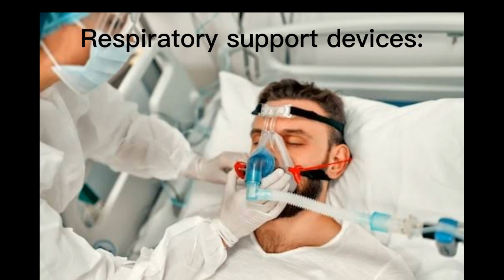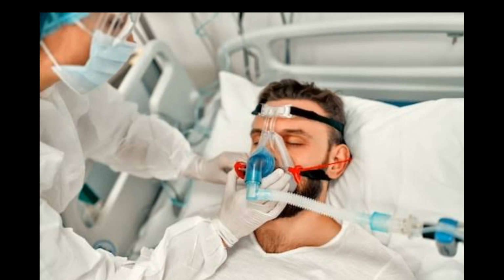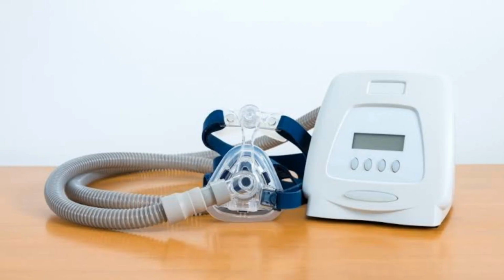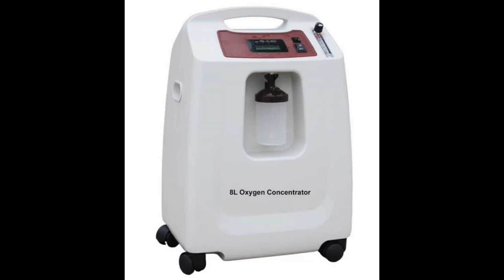So respiratory support devices are devices that help to improve respiration. These include our CPAPs, mechanical ventilators, oxygen concentrators, etc.